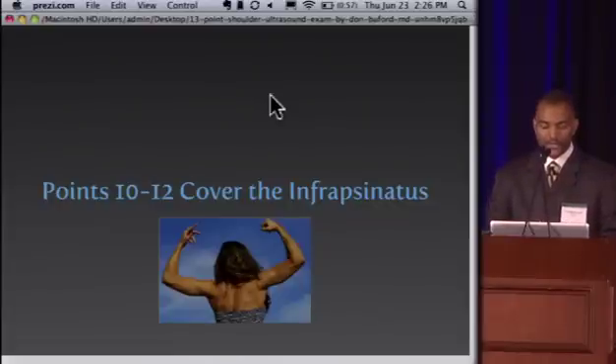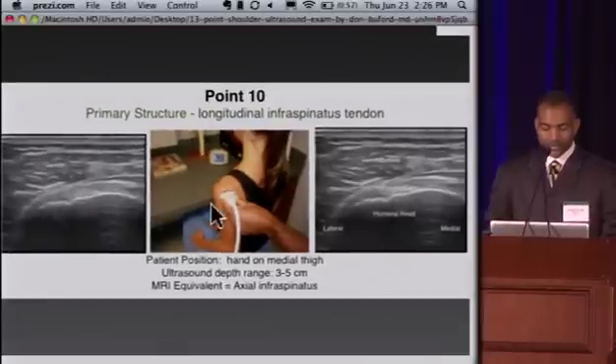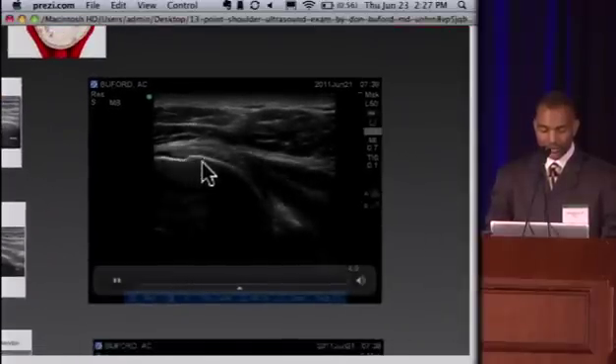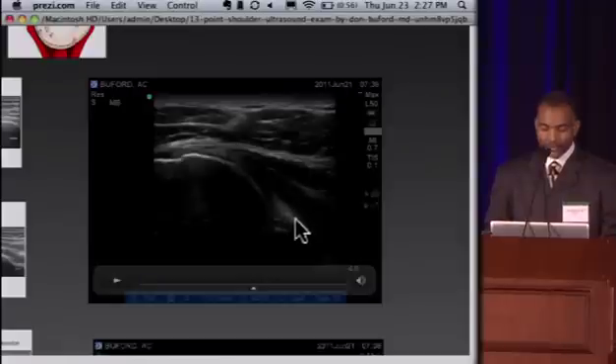Points 10 through 12 cover the posterior aspect of the shoulder, beginning with the infraspinatus. The transducer is placed just below the acromial spine on the posterior aspect of the shoulder. The insertion of the infraspinatus is visible laterally, with the cortical margin as a white line and the outer border of the infraspinatus along here. Done dynamically as the patient internally and externally rotates, you get a clear picture showing a portion of the glenoid — really the only portion visible by ultrasound. The hyperechoic triangular structure is the posterior labrum. The infraspinatus muscle tapers down and becomes tendon inserting laterally. For posterior injections, the needle is aimed for the labrum and can be guided beautifully with ultrasound.